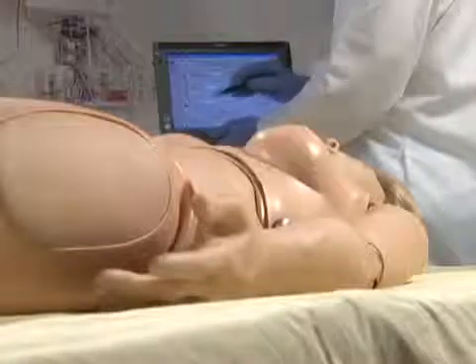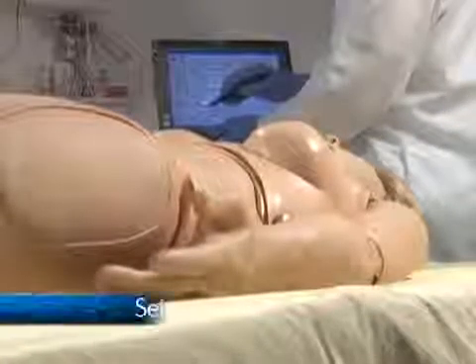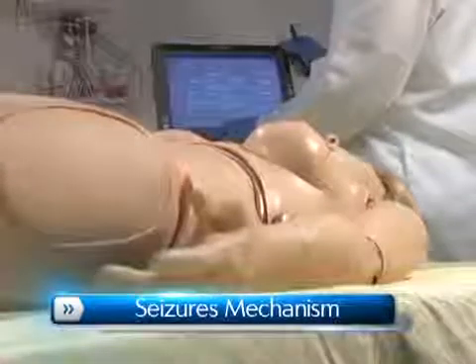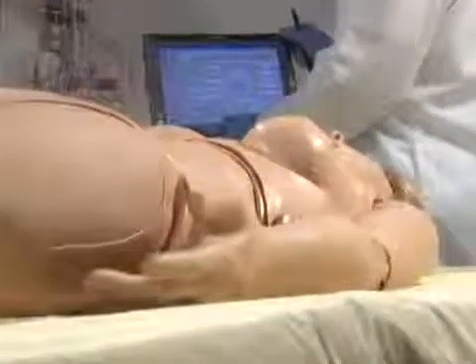Suzy is outfitted with a seizure mechanism that can be used in conjunction with scenarios. The severity of the seizures can be programmed with a touch of the stylus. There are two different intensities to choose from.